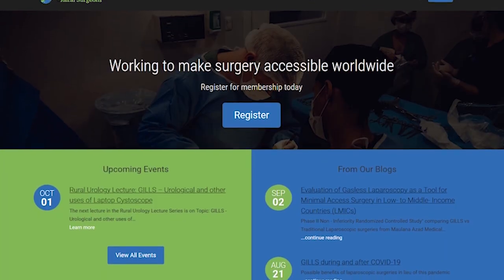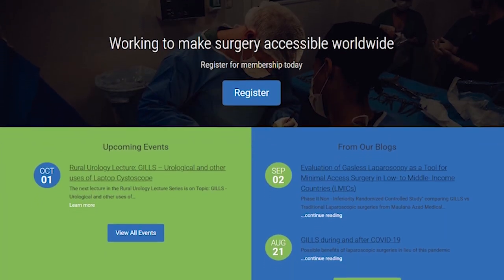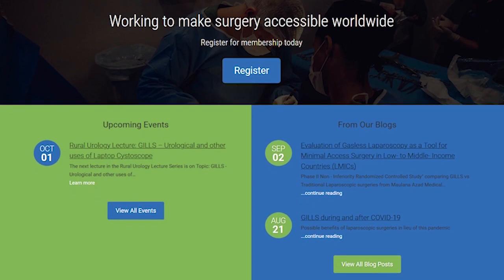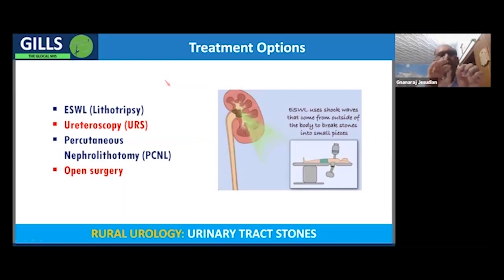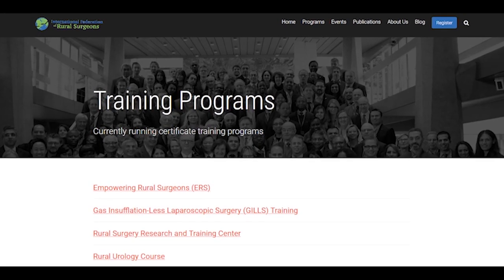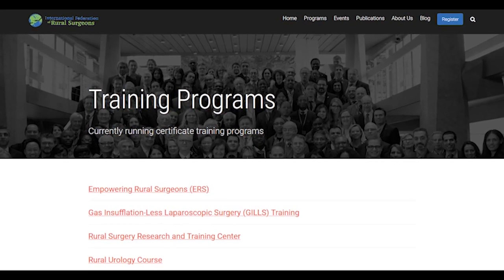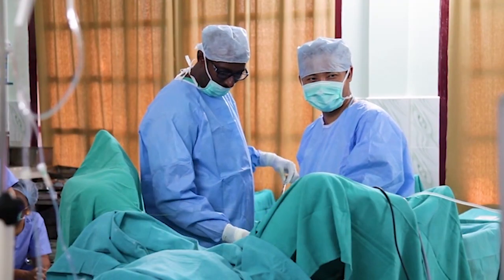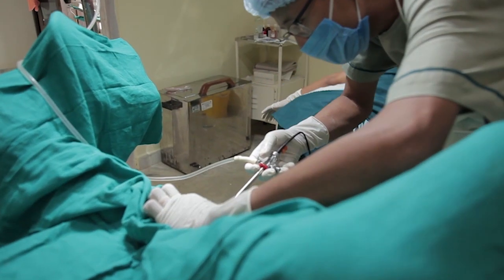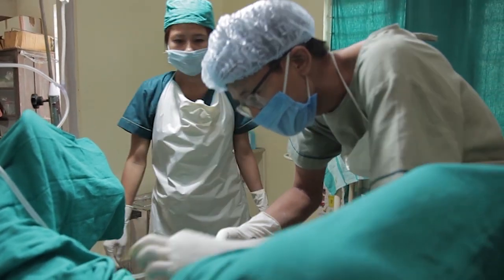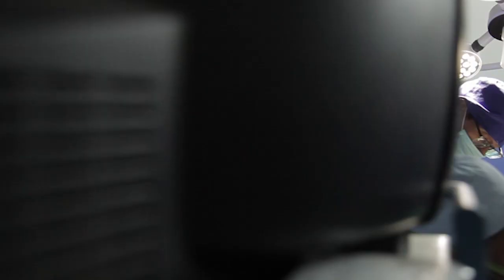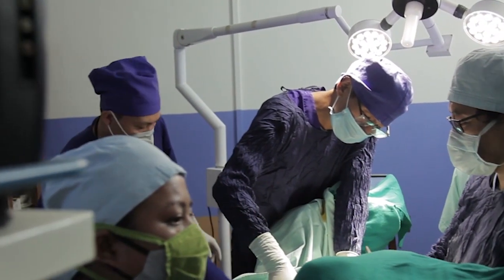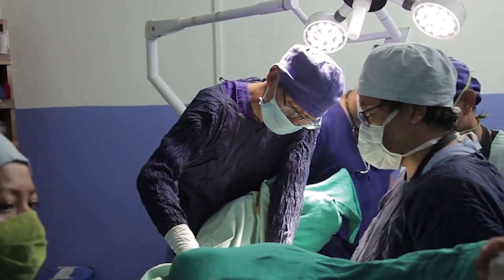The International Federation of Rural Surgeons and the Association of Rural Surgeons of India are collaborating to start a real-time online training program with university certification and accreditation. Few rural surgeons in Northeast India are already doing these minor procedures using the laptop cystoscope. Some urology and even some non-urology surgeries are possible with laptop cystoscopy.